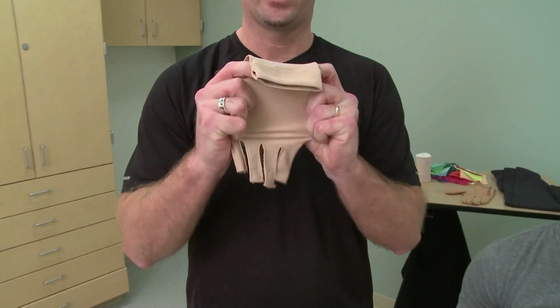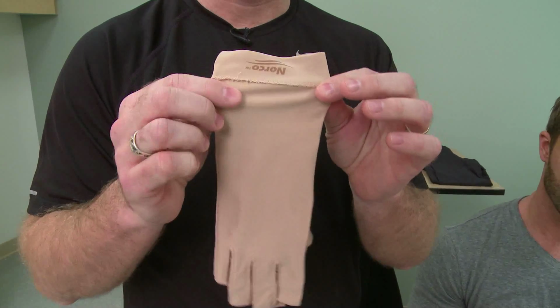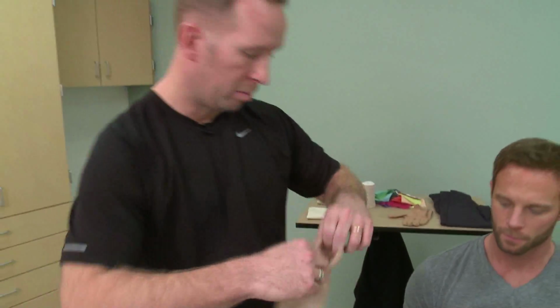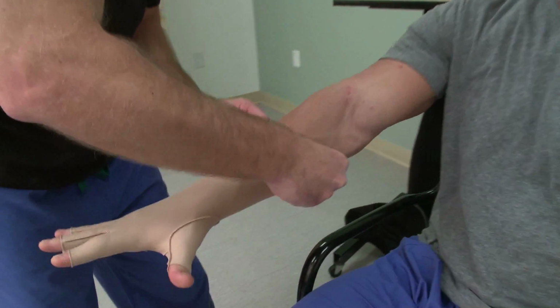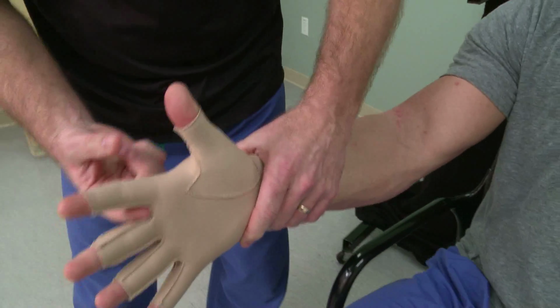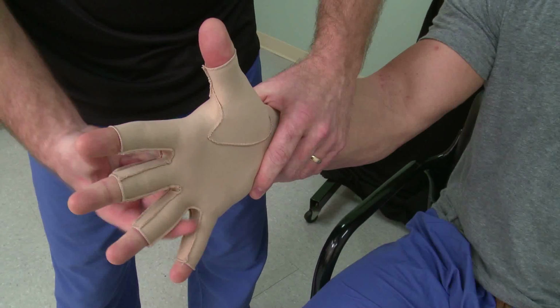This is an ISOTONER glove. It has light stretch and can help protect the skin and prevent swelling. I'm going to place this on Viren's hand, making sure that it's tight and snug deep into the web spaces.